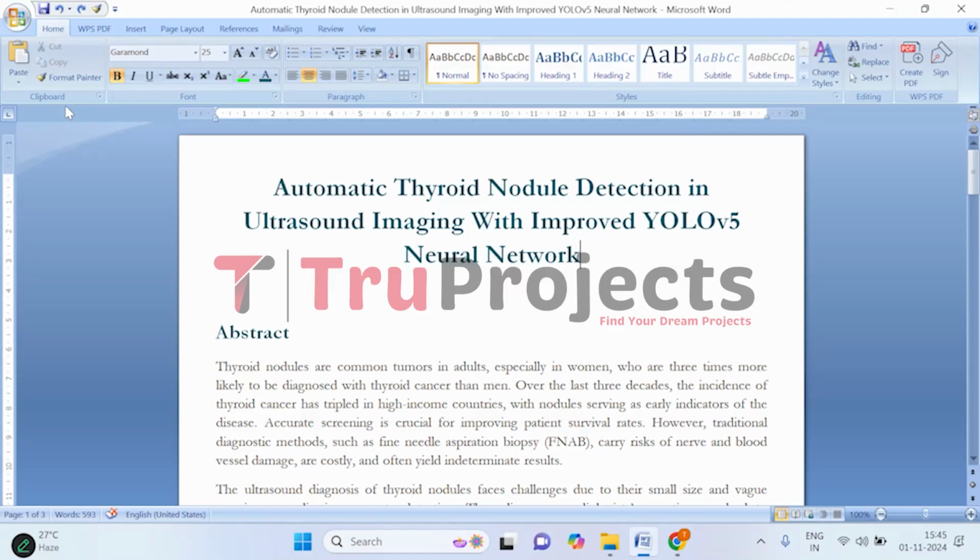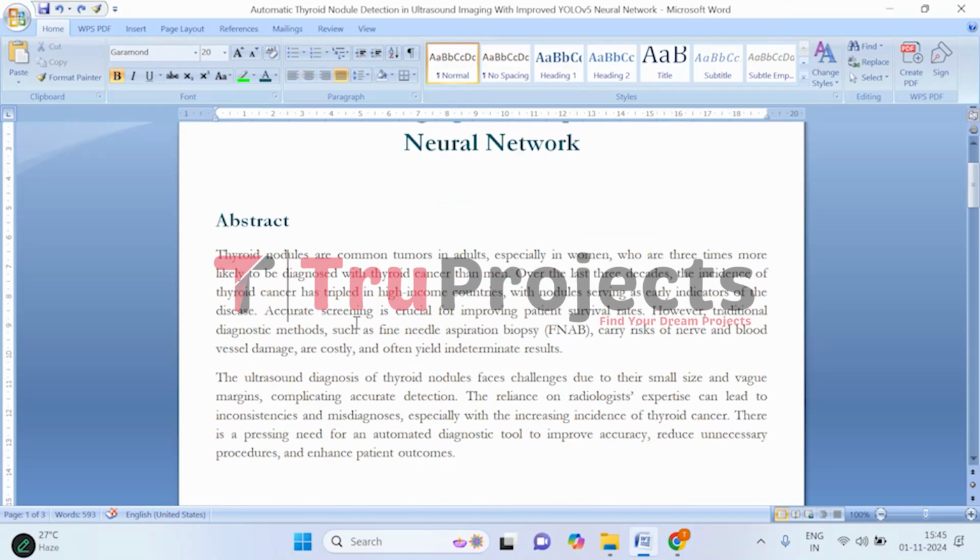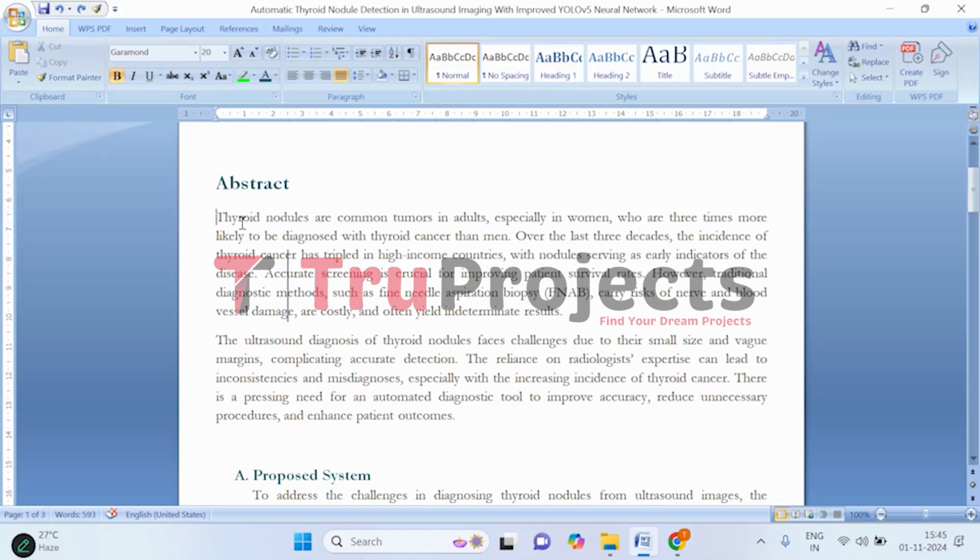two projects. In this video, we are going to explain the project, which is automatic thyroid nodule detection in ultrasound imaging with improved YOLOv5 neural network. So before getting into the execution, first let us understand what the project is about. So what is thyroid disease?